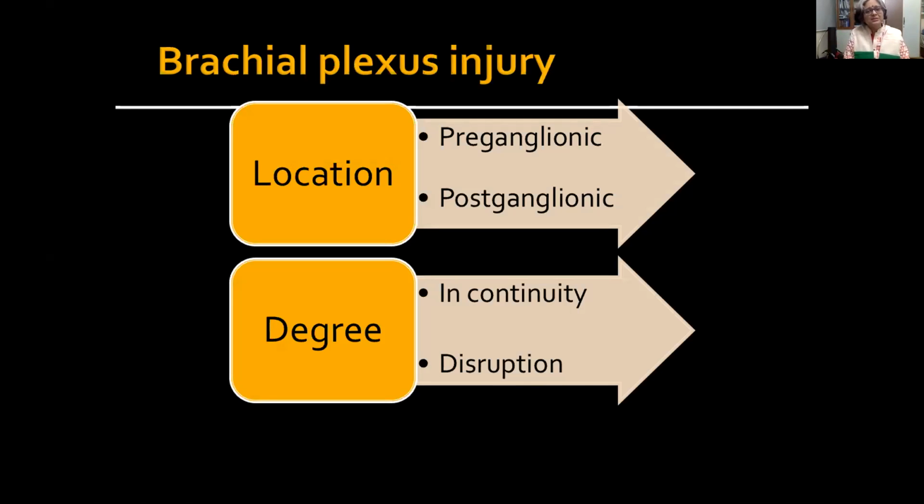Invariably these patients are scanned slightly later, because initially they have other fractures, maybe head injury, other injuries which are first dealt with being an emergency. After some time, they come to us for MR, which in a way works well for us, because in acute injury there is so much edema and hemorrhage that MRI becomes very difficult to interpret. So that slightly later works out well for us. At the same time, you don't want it too many months late, because then the muscle atrophy will set in and the management would be difficult.